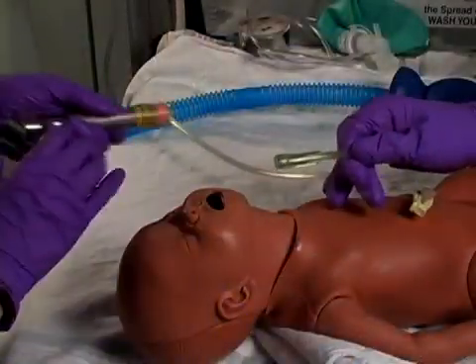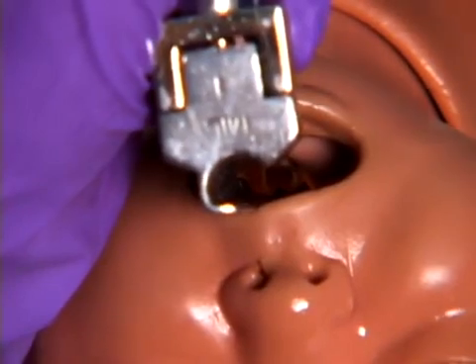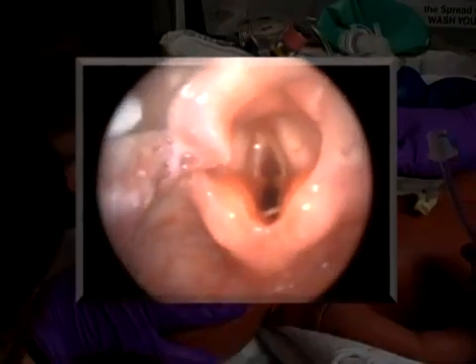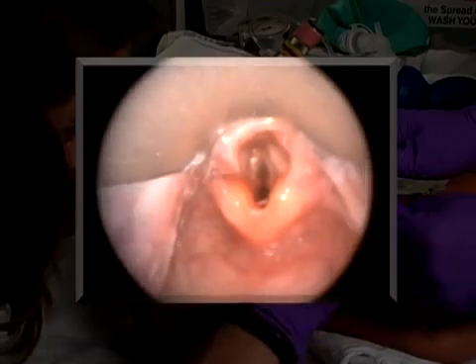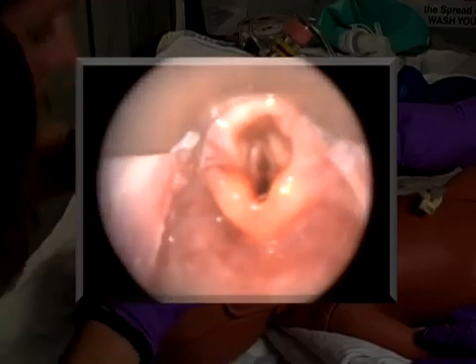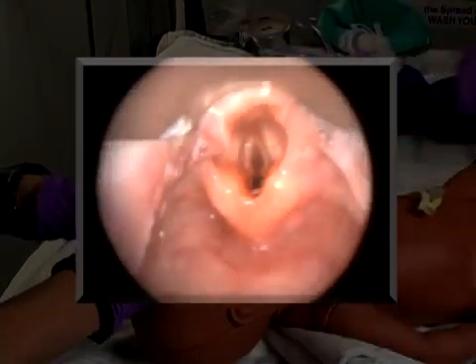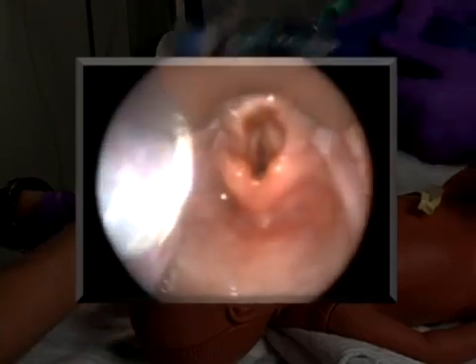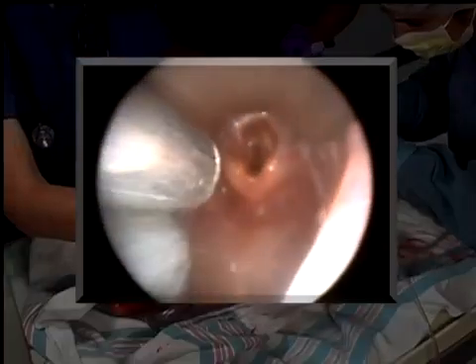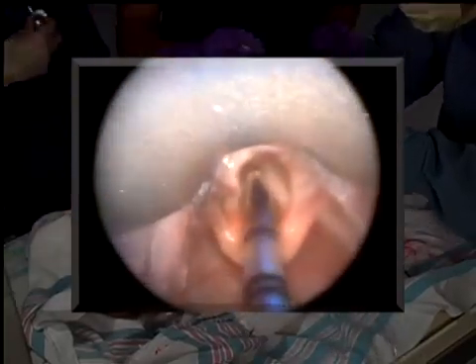Stabilize the head in a slightly extended position and deliver free flow oxygen. As you insert the laryngoscope, you can see the posterior wall of the hypopharynx. Elevate the laryngoscope slightly and you can see the epiglottis and glottis come into view. However, if you insert the laryngoscope deeper, you see the opening of the esophagus. If the laryngoscope is to the left or right of the midline, you can see only part of the glottis. Insert the laryngoscope to the proper depth in the midline, and the epiglottis comes into view, serving as your landmark. At that point, lift the blade of the laryngoscope upward and away so that the vocal cords come fully into view. Sometimes pressure over the larynx will help visualize the glottis.